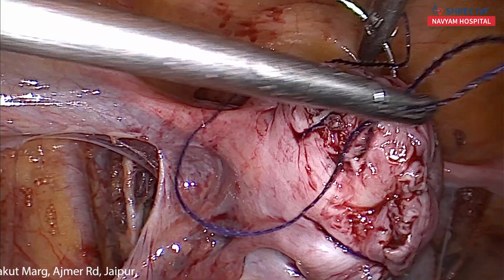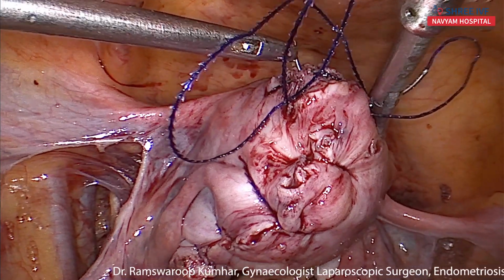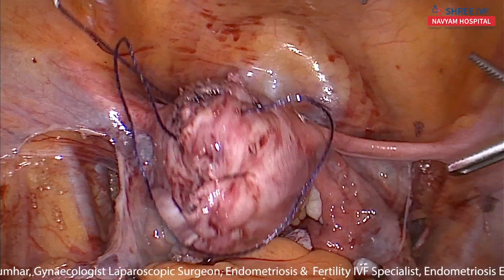This suture line is loosened by the removal of the fibroids again, so we will take 1 or 2 bites on the anterior side.